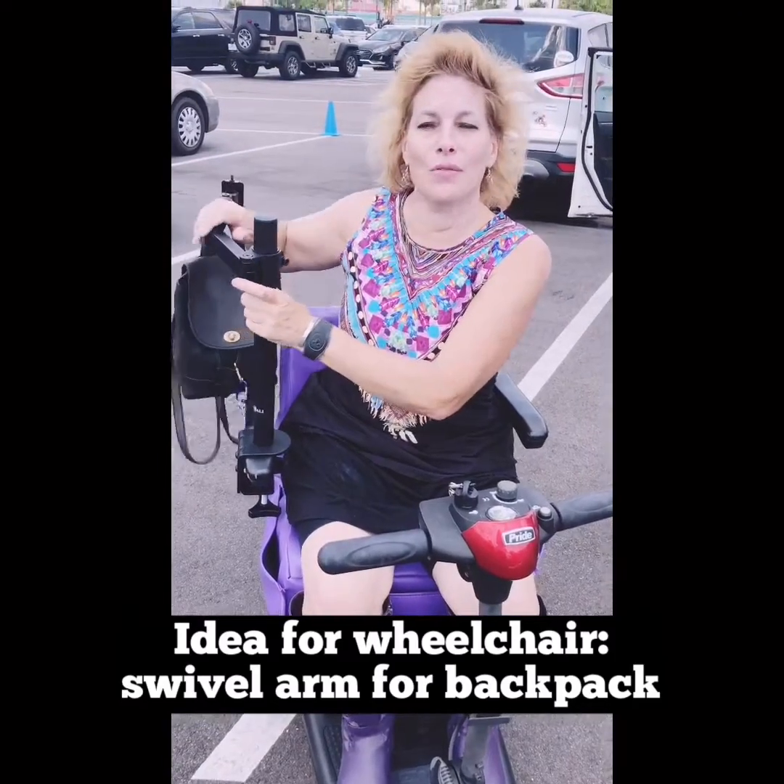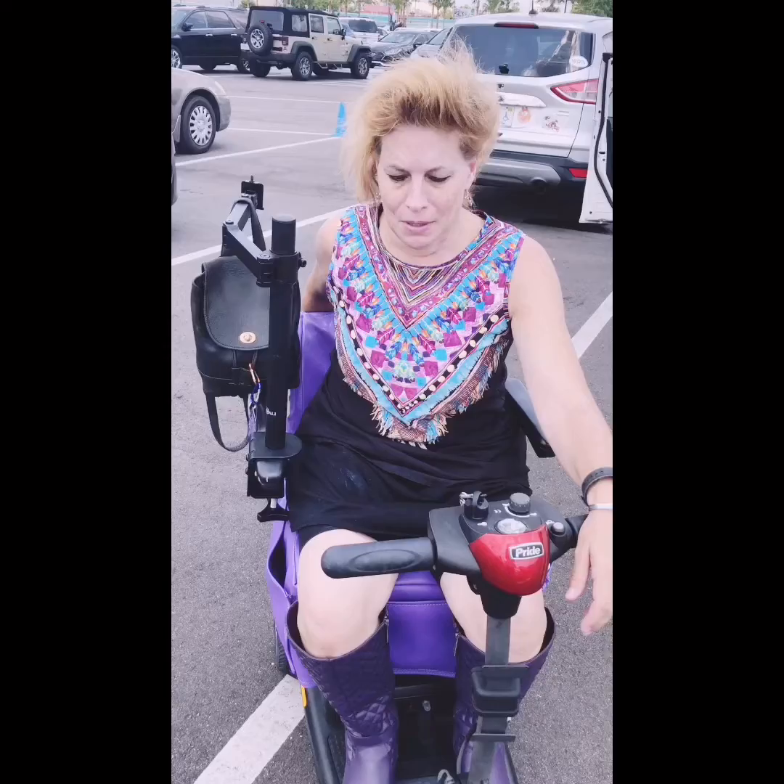We're working on an idea I had when I was trapped in one of these and couldn't walk at all. I realized that when you're in a wheelchair or a buggy and you want your stuff, you always keep your stuff on the back of the wheelchair. And you want your stuff — what are you supposed to do? Hop out and run around and get it? You're trapped in a wheelchair.